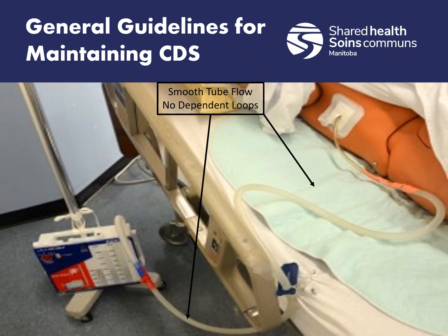With that as well, we just want to make sure that we're keeping an eye on it. When we pick up the device, we always want to keep it in this position, as you can see here, ideally. But we also want to monitor the color, character, consistency, and the amount of drainage in the chest tube drainage collection unit chamber. Now if they're just dealing with a pneumothorax, there may not be any fluid at all. That's good to note as well, because if all of a sudden there's fluid or drainage like blood, that could be an indicator something's not right, versus they've steadily got some blood or some pus coming out of there at irregular intervals.